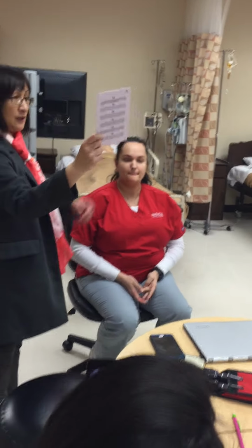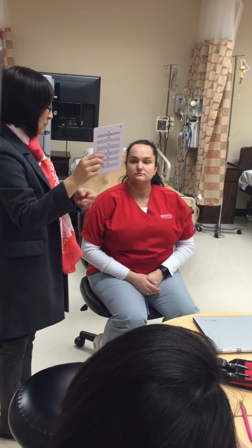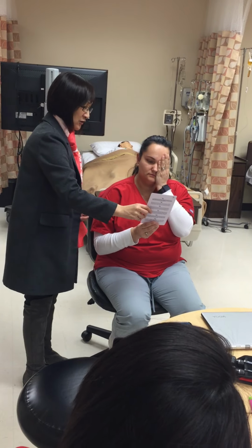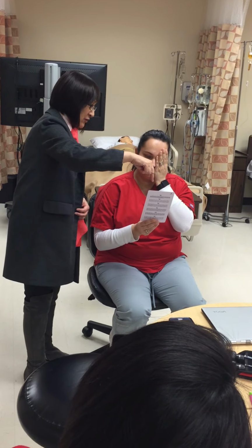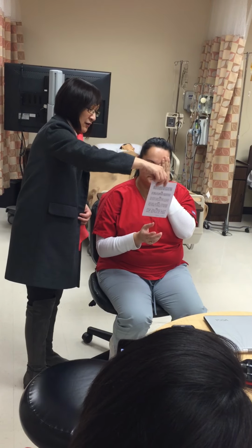Then we move on. You will now test her near vision using the Jaeger chart. If you remember, this is two-sided. As the patient covers one eye, hold this about 14 inches away. Can you read number 7? Able to read those. Yes. So if she can, flip it.